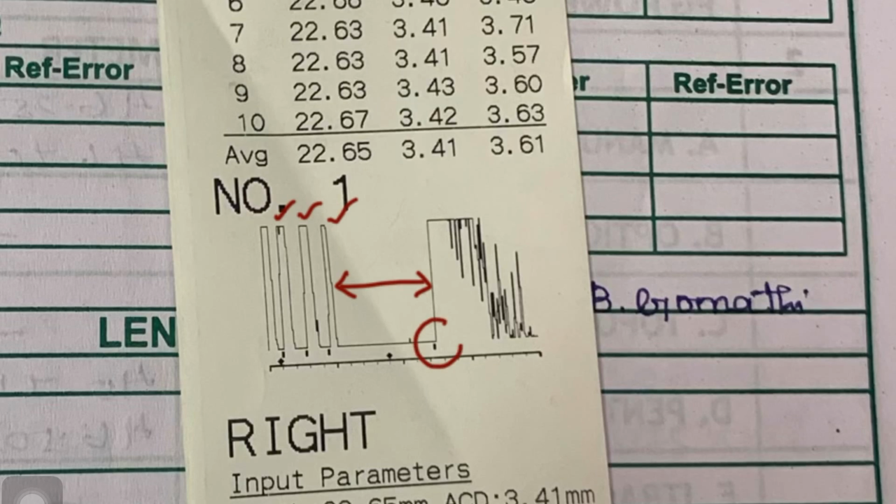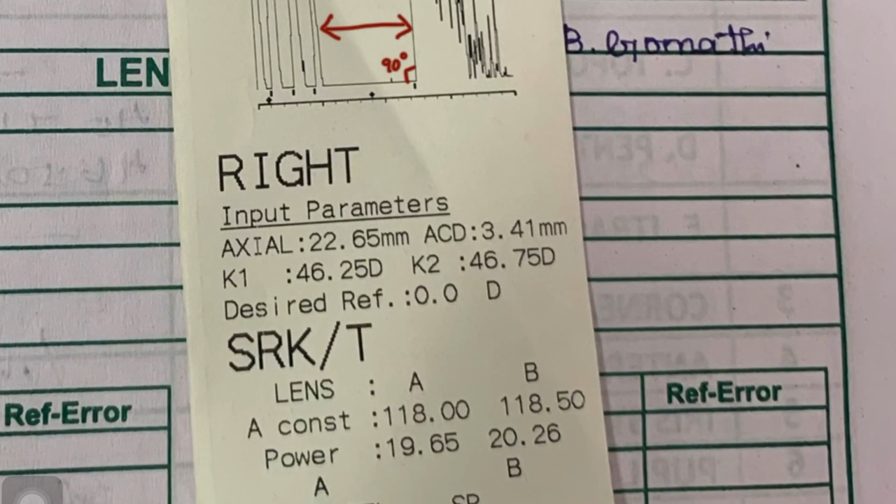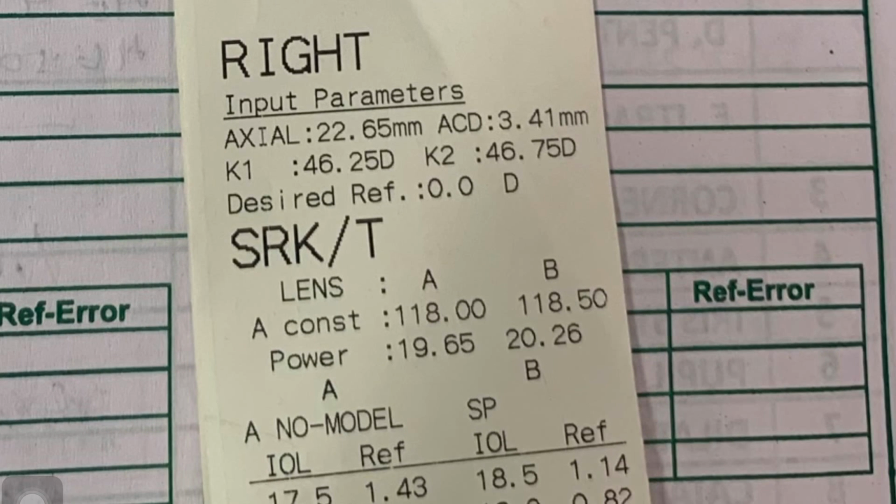Takeoff angle of retinal spike must be 90 degrees with the baseline. The retinal and the scleral echoes should also be seen. And for IOL power calculation, the input parameters should be verified along with the IOL formula, following which the A constant should also be verified.